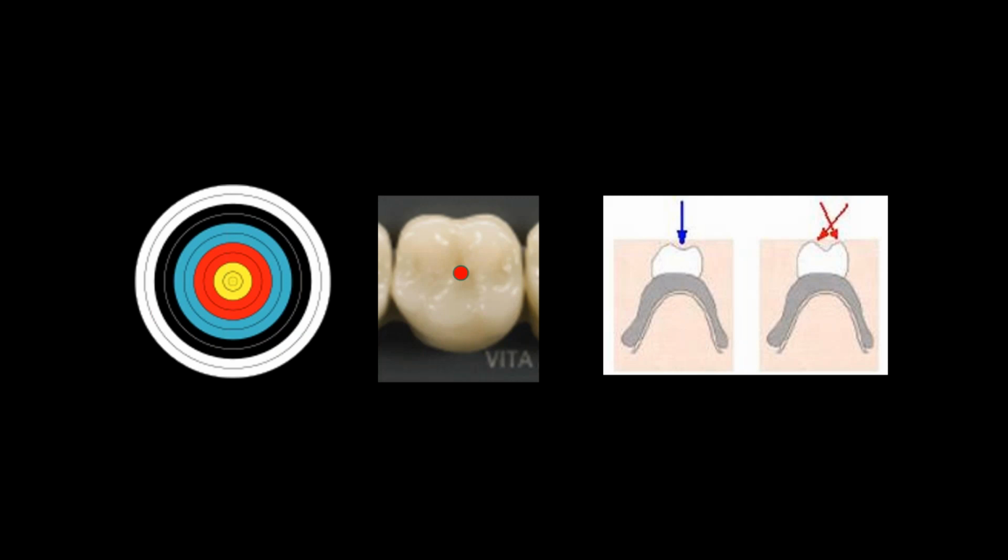So what does that cause? Remember I said the denture fits, but food collects under it because now it's rocking and it's lifting the denture and food gets under it. What happens is then the teeth chip. The teeth can chip as well because again, we locked everything in. This cycle is anything but locked in.